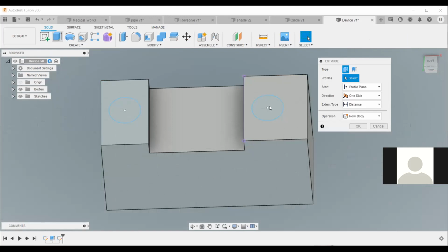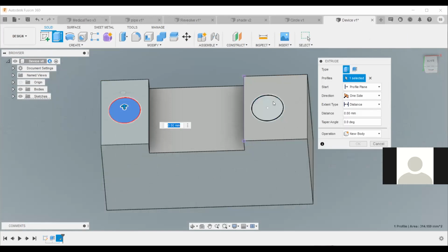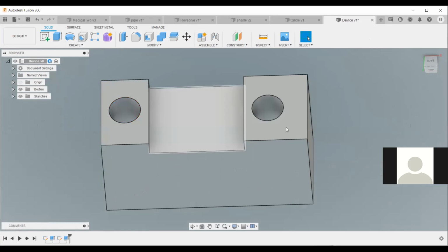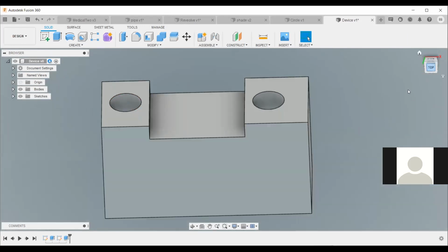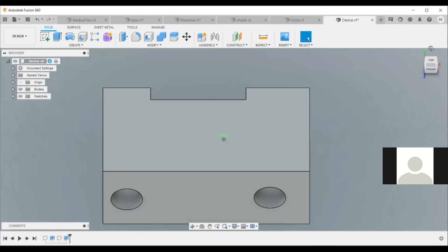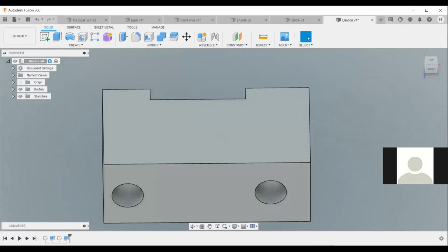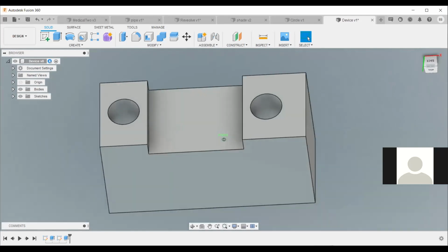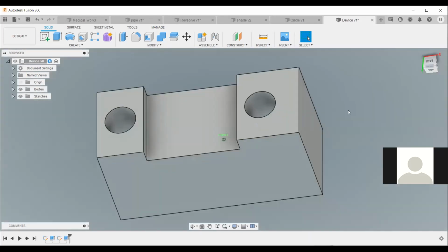So you click on that, you hold. Click on this also, you hold. You can decide to let it go all through. You say here, direction, distance, extent, side, you say all, so that it is all through. Okay. Guys, have you seen that? Yeah, see, hiyo ni rahisi.